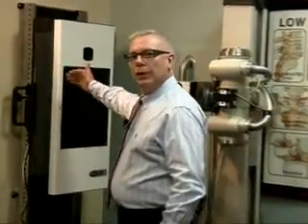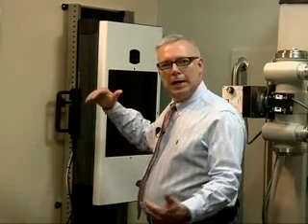Now, as opposed to what we used to do, which was take an X-ray that was in what they called a bucky, which was an instrument that held a cassette, which held an X-ray film. Once we took that film, we would then take that into our darkroom and develop that using chemicals and go through a whole arduous process. That wasn't something we could automatically do on the fly with treating patients, and the quality of the image was limited by the technology that was available.